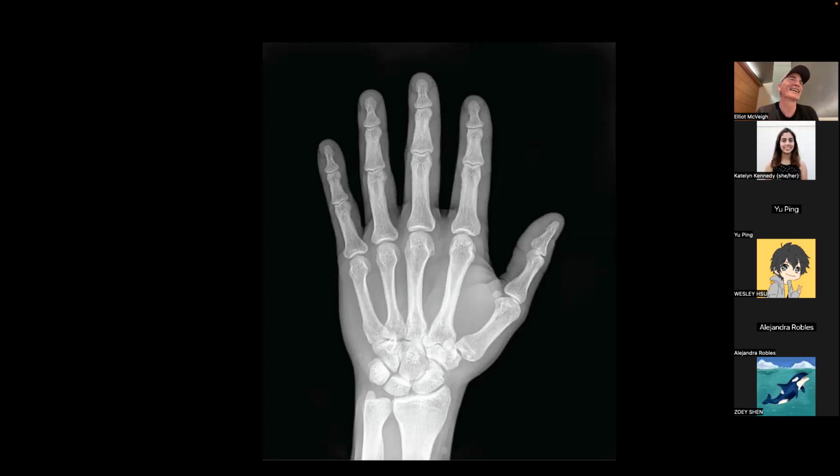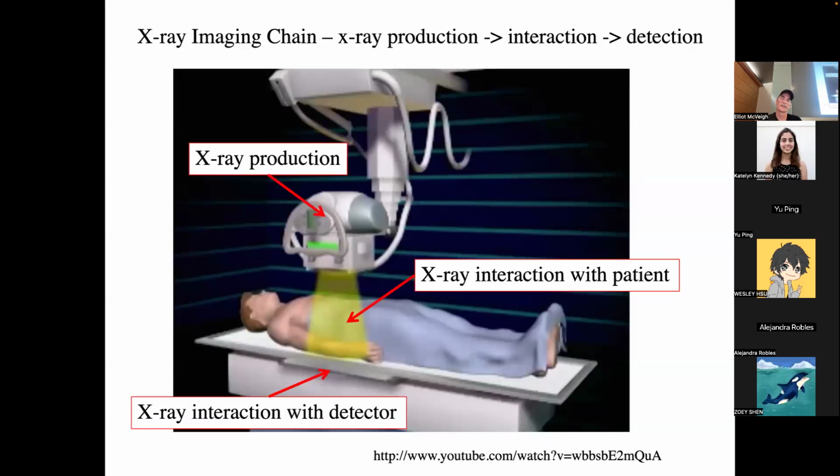People are somewhat more comfortable looking at something and saying, oh, it's illuminating something, as opposed to it's causing a shadow. When they did this on film, did it come out looking like this on the actual negative film, or the opposite? No, it comes out looking like this, because you basically have more flashes where the X-rays are. So it's like optical film in the visible spectrum, basically. So whenever you see somebody reading X-ray film, it's in this orientation.